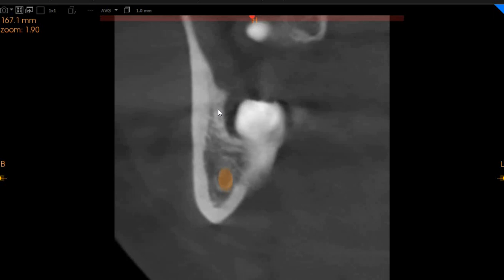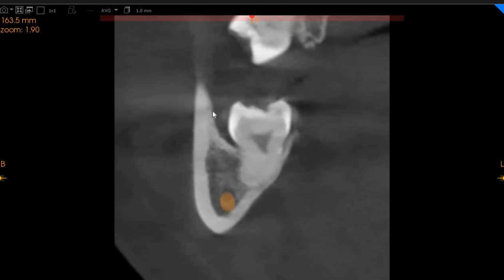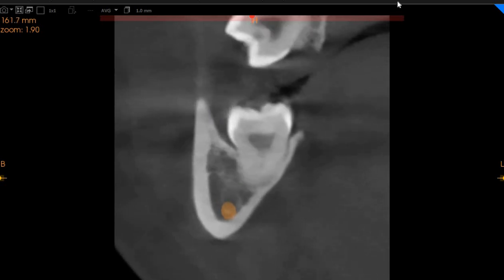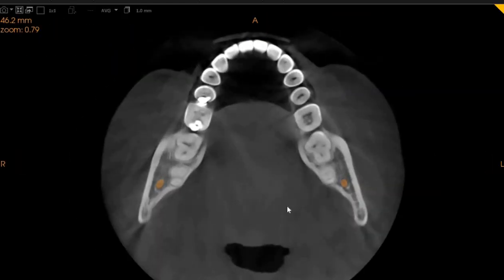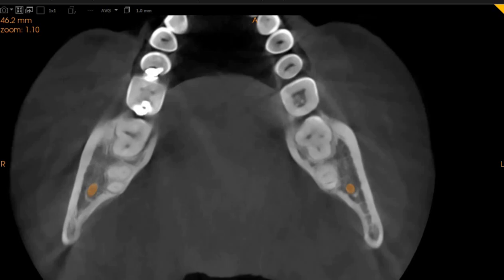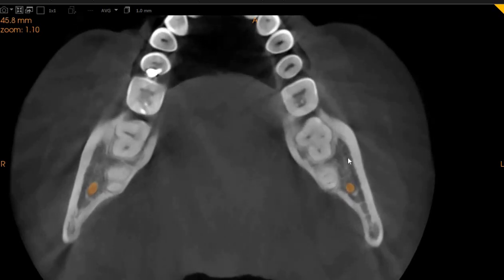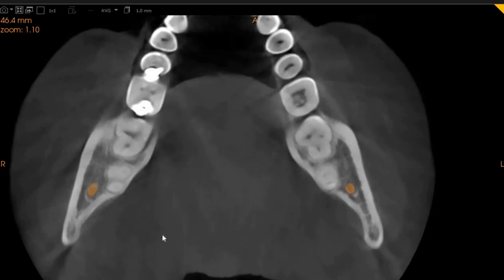If we show you the area, this is the distal-most aspect, and at no point does the inferior alveolar nerve come in contact with the wisdom tooth on the lower left-hand side. So this is quite significantly away. On the axial view you can also see this is the lower left side — zooming in, you can see the wisdom tooth is quite significantly away from the inferior alveolar nerve.